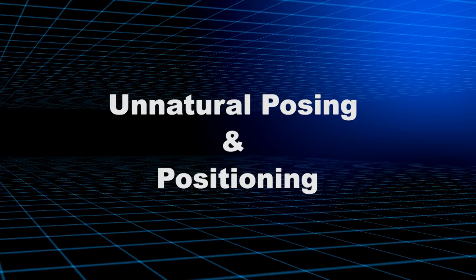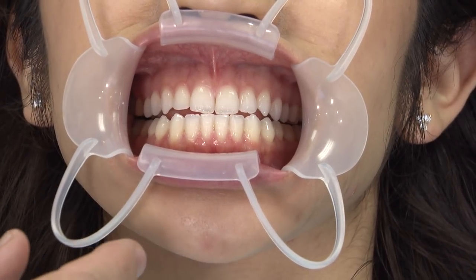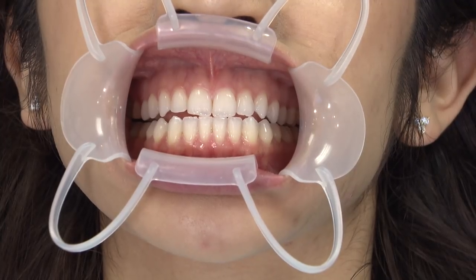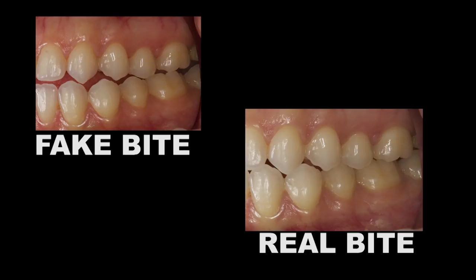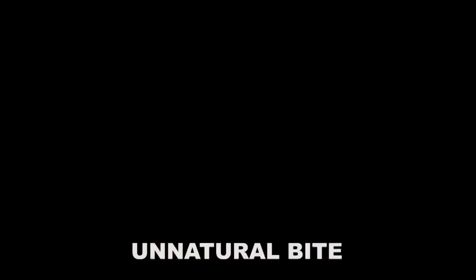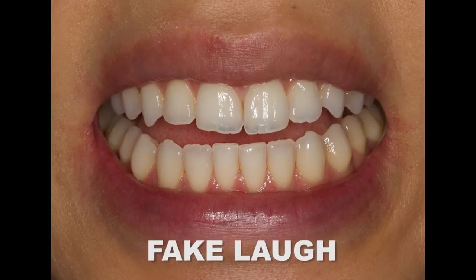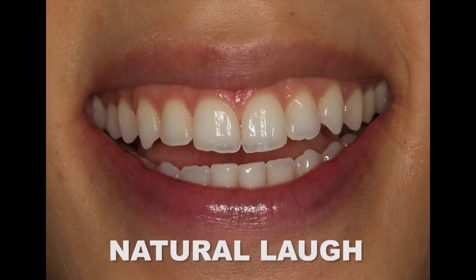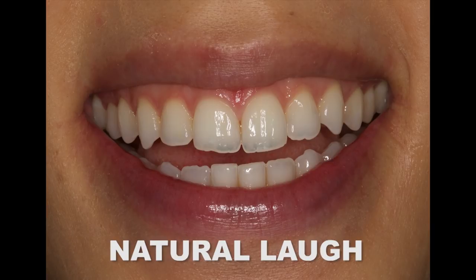Most times, when we ask a patient to perform a specific movement — maybe as simply as biting down into normal occlusion — the patient will attempt to overthink that action and smile or bite unnaturally. It is important to practice the specific actions that you are requesting with the patient and pay close attention to overzealous positions such as the protruding of the jaw, fake stretched smiles meant to show the teeth rather than smile naturally, and the failure to bite completely into centric occlusion. Specifying exactly what is required in each step of the photography process and coaching the patient along the way will ultimately result in photos that can be used for marketing, education, and as legal documentation.